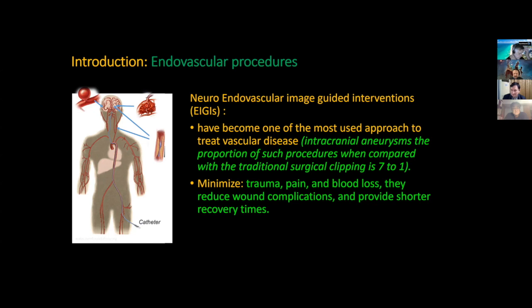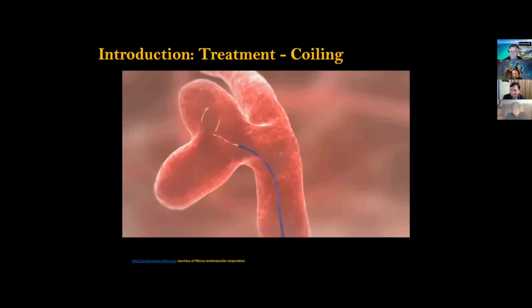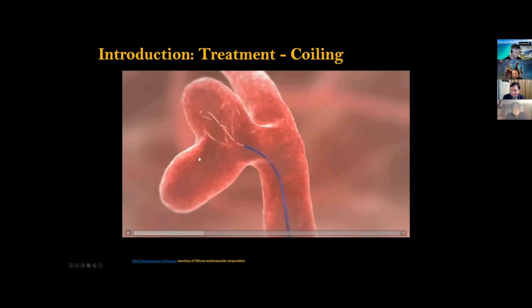Well, the issue with this is that some of the procedures that we do, the devices that we use are limited. We do not have ways to measure directly the effect of the treatment that we're doing. And a lot of these procedures may require additional follow-ups. It's not uncommon for an aneurysm treated with coils to see 2 to 3 follow-ups where coils are being added due to incomplete occlusion, etc., or coil compaction. So I'm not sure how many in my audience are trainees or residents, and I will go over this a little bit because they are the main focus of the presentation.